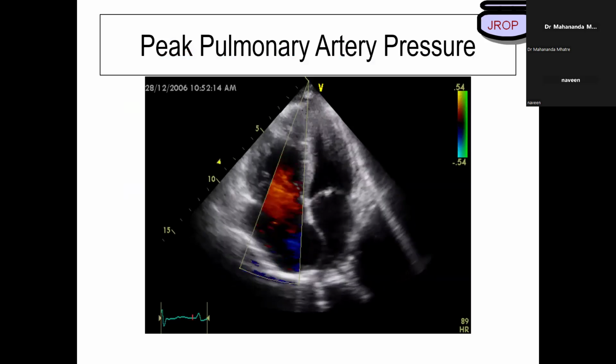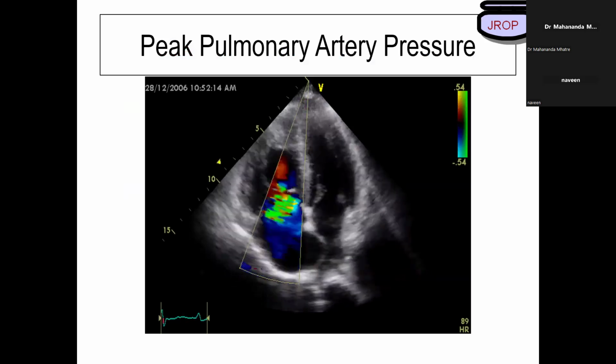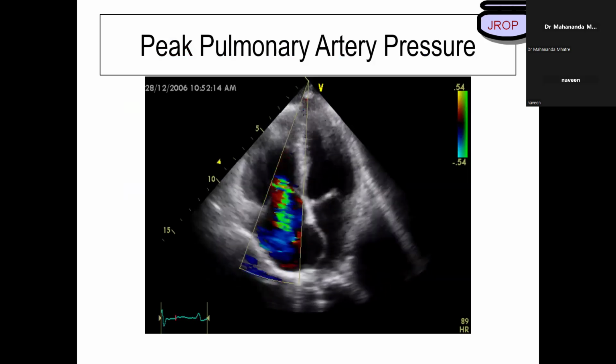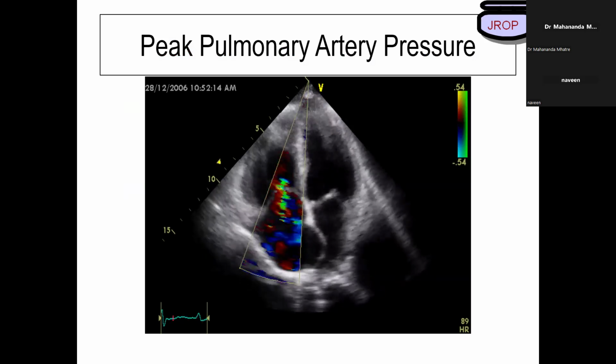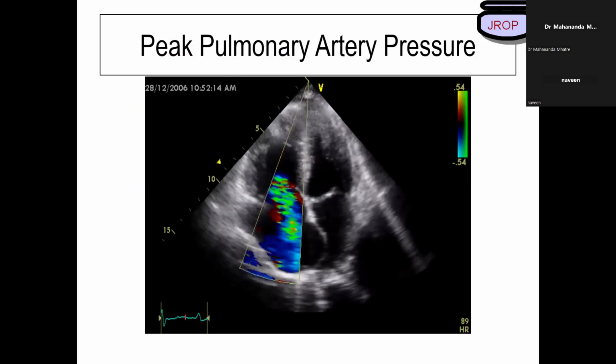One more question for Dr. Matre. Dr. Matre, tell me in which window you will get the maximum TR-jet in this patient? Focused RV? I've given you enough hint.